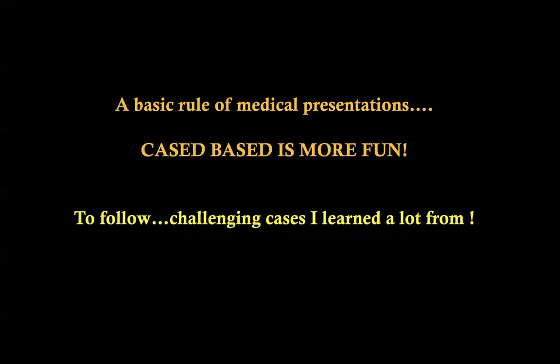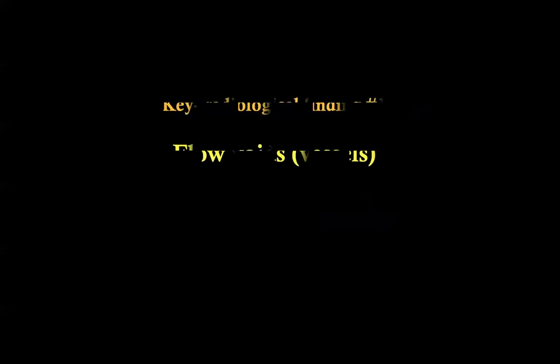And then a second part of this presentation is cases, because cases are more fun, and also from difficult cases we learn a lot. And I want to show you some cases, and I will start from key radiological findings.